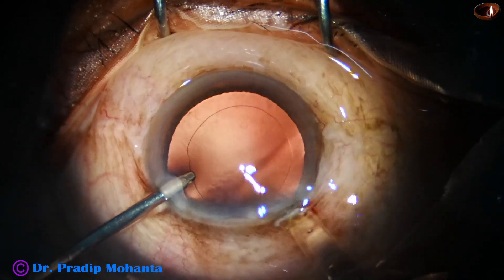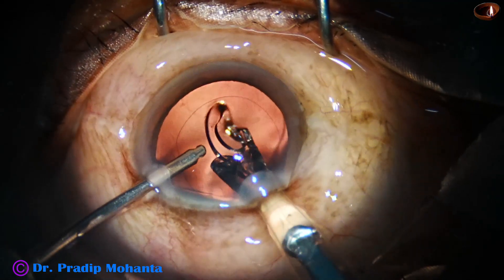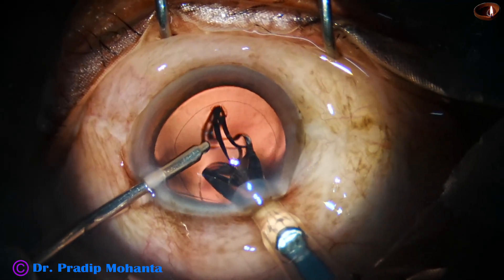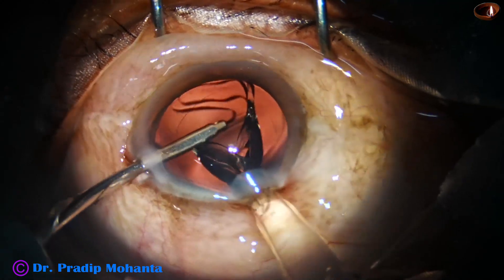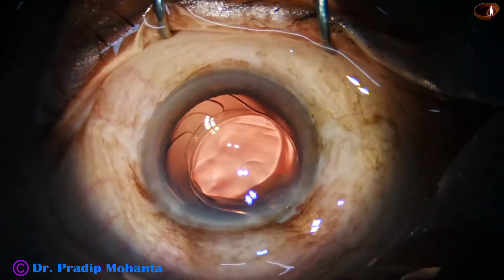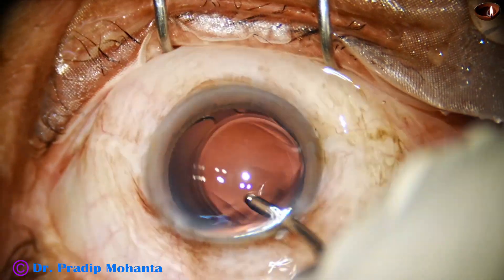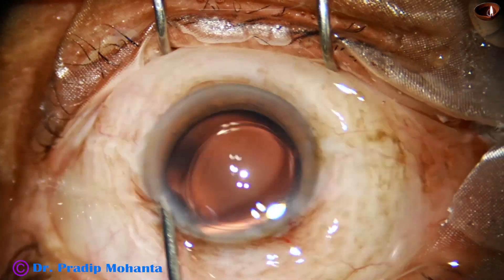And now here goes the lens. The single-piece monofocal intraocular lens is being placed in this case. And it goes in the bag. The lens is dialed by the irrigating probe itself.